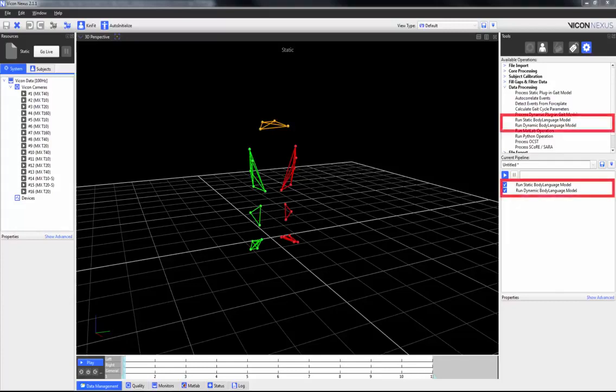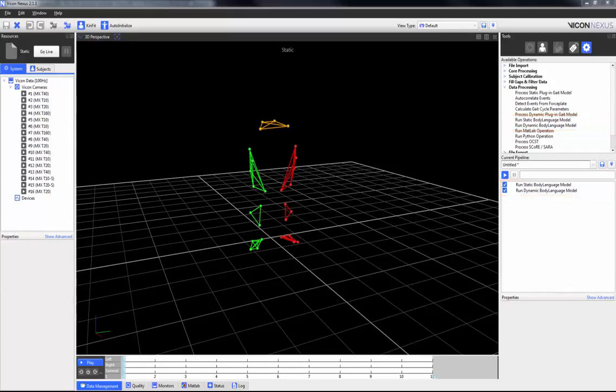The run static and dynamic body language models allow you to run static and dynamic BodyBuilder scripts, which in turn allows you to perform biomechanical modeling. The advantage of this pipeline operation is that it allows you to run scripts and therefore biomechanical modeling directly through Nexus, and you can see the results in real time.